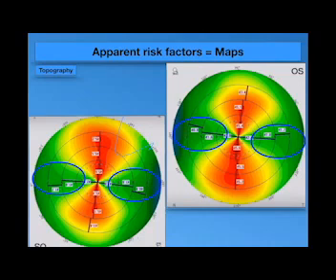So if there is any deviation of one of the lobes of the bow tie, especially the superior or the inferior one, and there is an angle between them which is more than 15 degrees, you may suspect. If this angle between the superior and the inferior lobes of the bow tie is more than 21 or 22 degrees, you have to highly suspect this patient has corneal abnormal points. Please don't worry about the superior steepening. The most worrying is the inferior steepening.